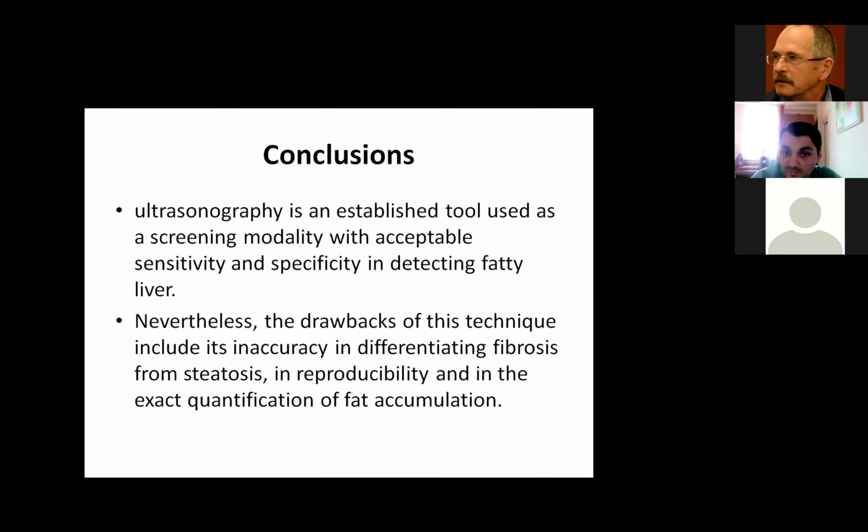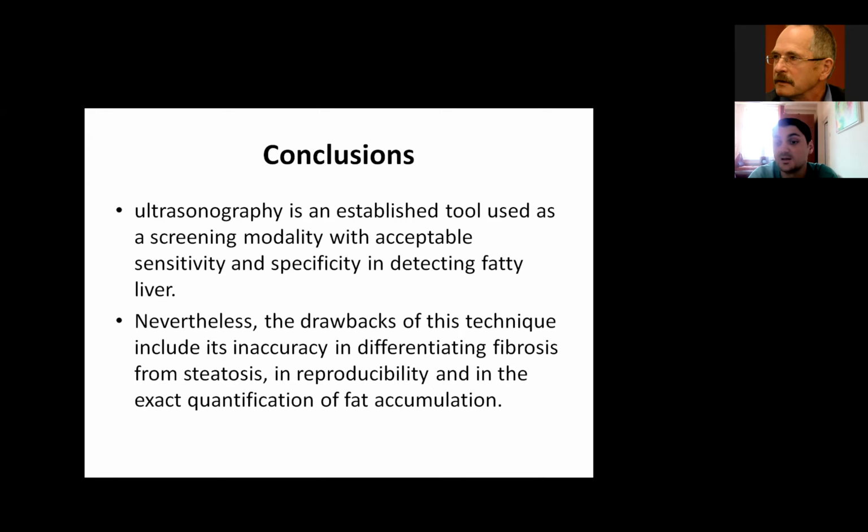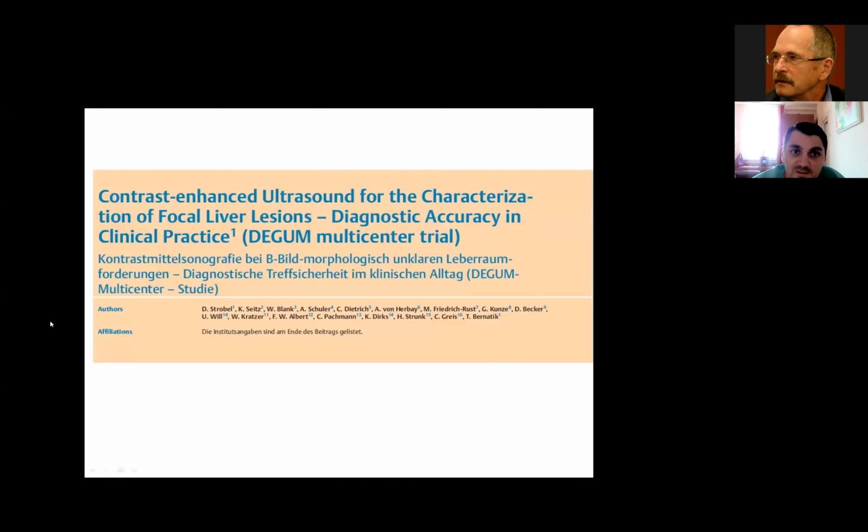And as for the conclusions, we have to keep in mind that ultrasonography is an established tool used as a screening modality with acceptable sensitivity and specificity in detecting fatty liver disease. So it's the first weapon and the first tool in evaluating and establishing this diagnosis. Nevertheless, it also has some drawbacks because it sometimes might be inaccurate and also has some problems in differentiating fibrosis from steatosis, and also in the reproducibility of the method. We have some drawbacks. This was the first paper, about hepatic steatosis evaluated by standard ultrasound.